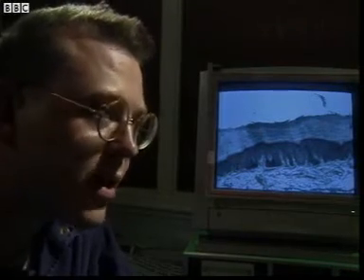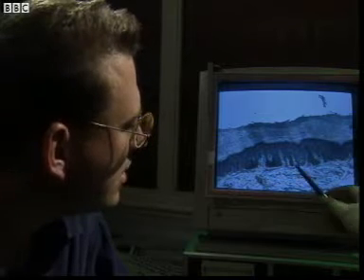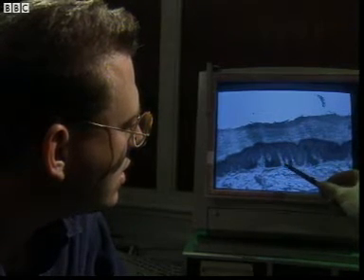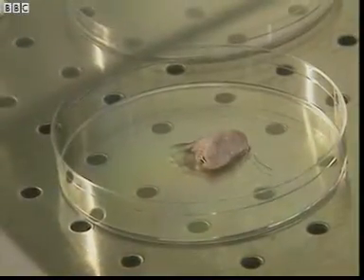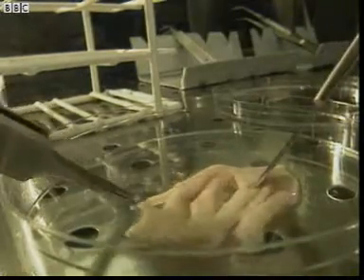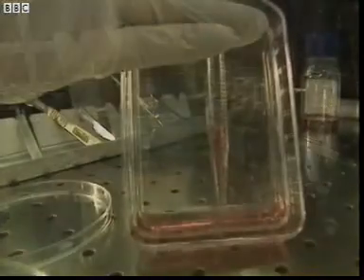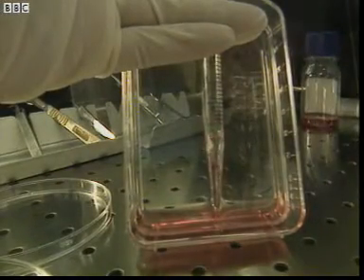So in your lab you're trying to grow the skin cells? Yes, what we can do is grow these lower cells. These are the ones that divide very rapidly. What we do is we take a piece of skin, and those cells can be put out into special culture medium, and they settle down on the base of the culture flask and begin to divide. So how much skin do you need?